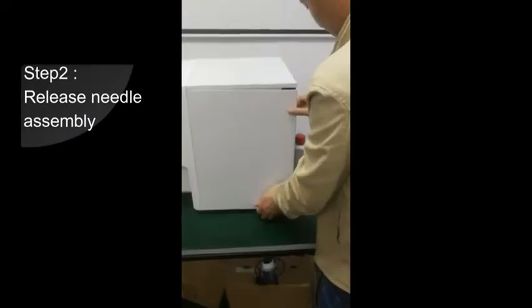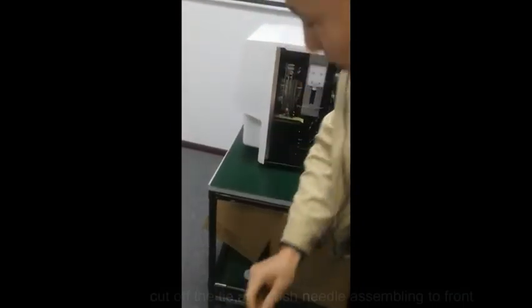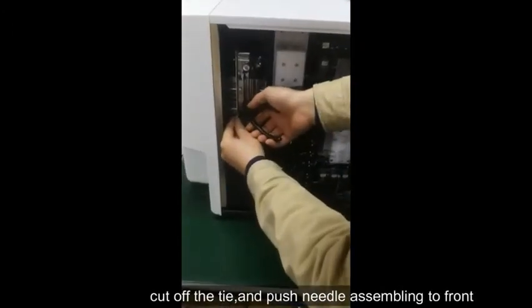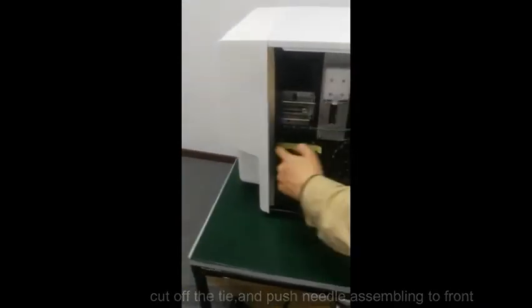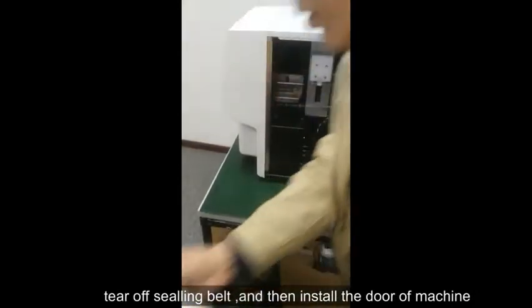Step 2: Release Needle Assembly. Cut off the tie and push the needle assembly to the front. Tear off the seal belt, and then install the door of the machine.